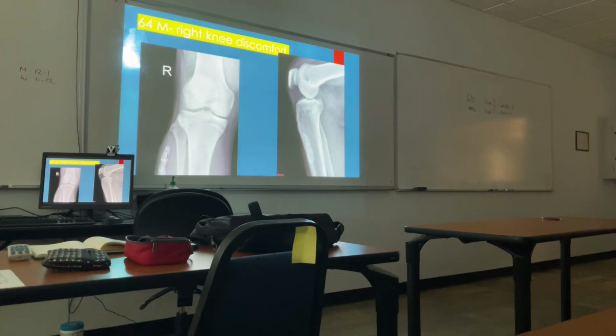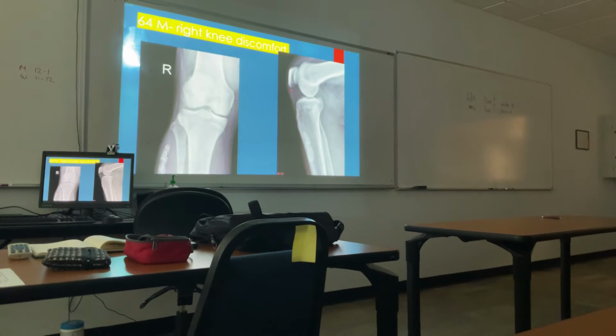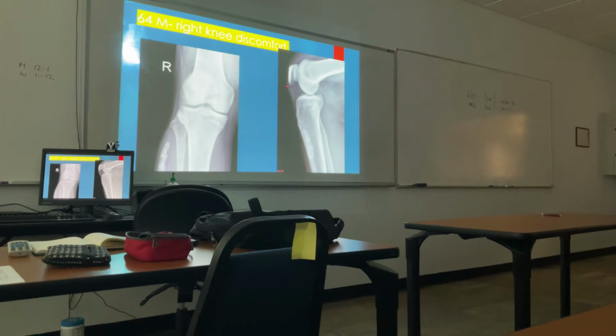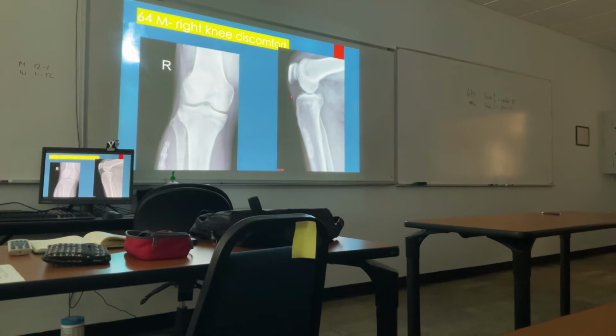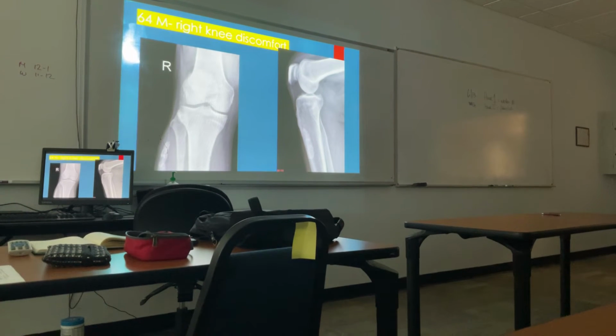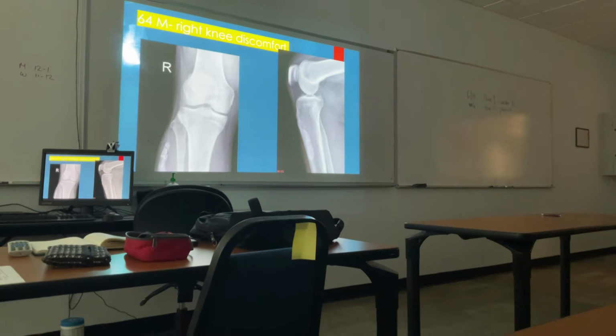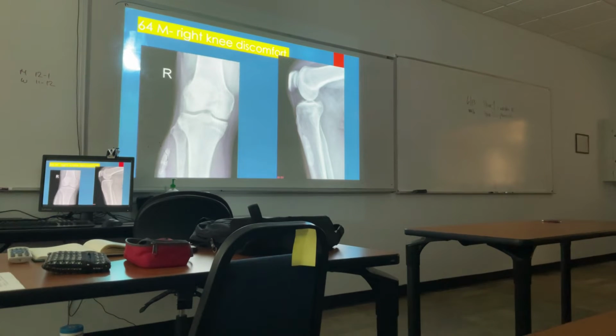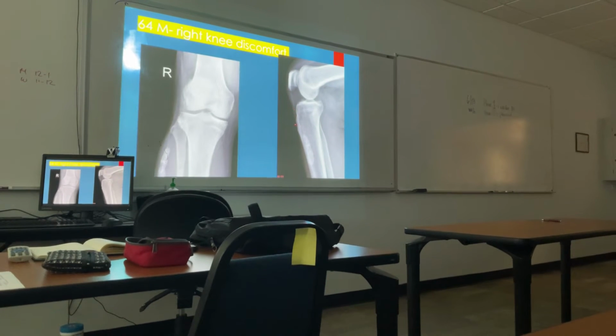Patella. Okay, but again, same thing, if you make it bigger on your device, there's a little spur coming off the inferior aspect. Okay, that's how they start. So if you have abnormal patellar mechanics, this is what can happen. If it's tracking horribly, this is not the examination, that's a clinical evaluation, but there's sensitive instruments where we can follow tracking. On the x-ray, all we're saying is there's spur formation, probably secondary to the abnormal tracking, and if it keeps abnormally tracking, this is going to get larger and larger and larger, and it affects the infrapatellar tendon.